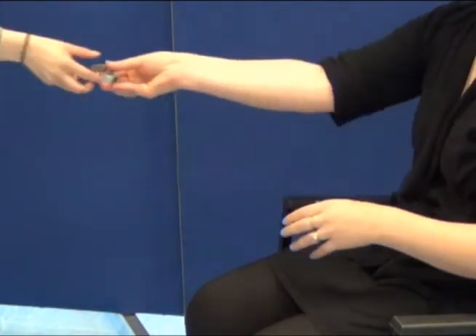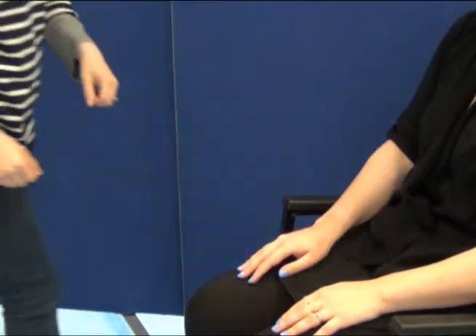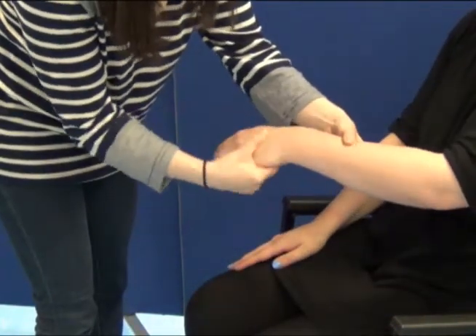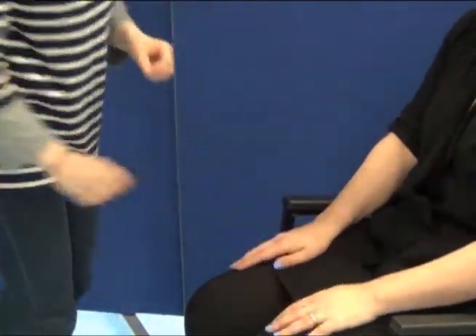Before you start, make sure that the patient has removed all jewellery. Electrodes will need to be placed on the skin, so make sure the skin is clean and dry, including free from moisturiser. This will ensure sufficient contact with the electrodes.